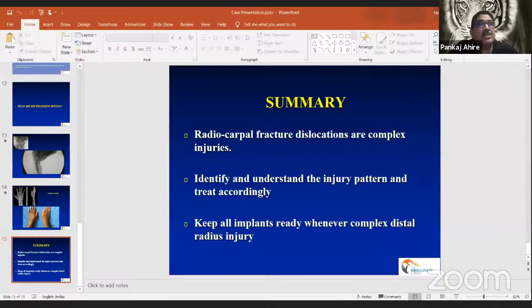Any of the panelists would treat this any differently from what Sanjay has done? You have a vast experience of 200 cases. But as I understand, once you remove these wires, which are kind of a jack for the intra-articular piece, being in the cancellous area, if you remove these wires, won't it collapse? These wires are removed only at 6 weeks. So because that's a void, doesn't it collapse? No, I can show you the post-op. No, I'm just asking. I'm just learning.